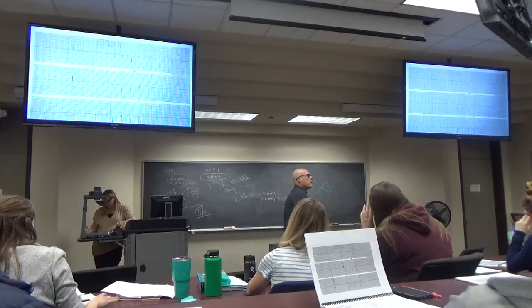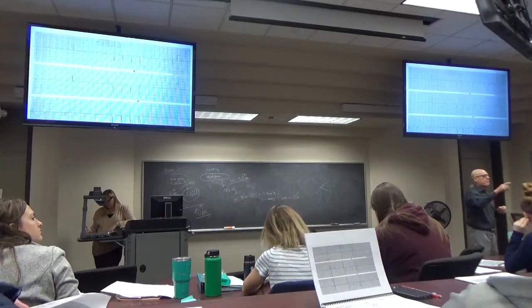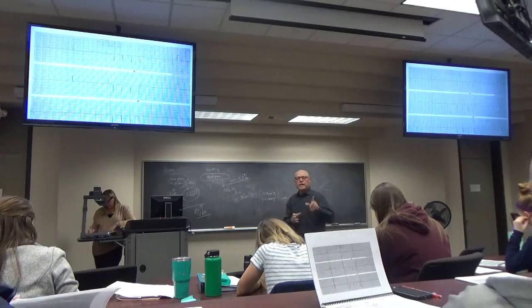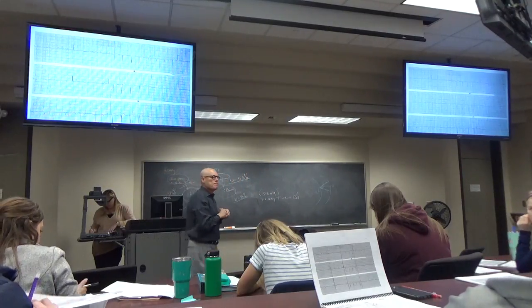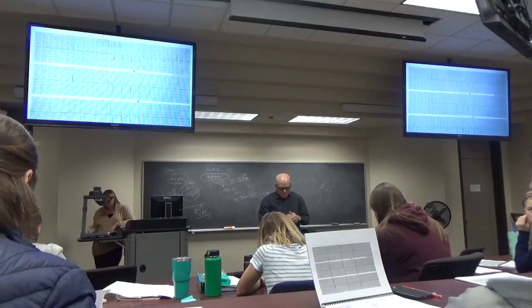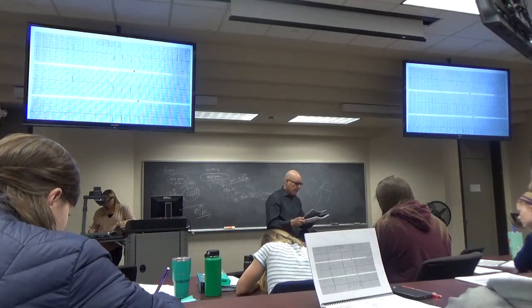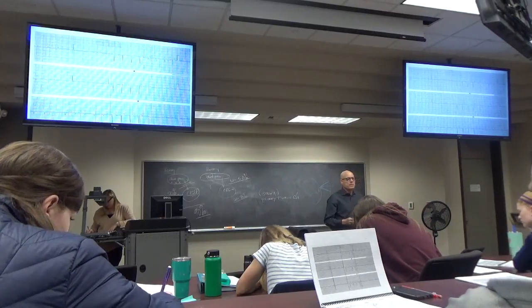So that would make you look more carefully at the ST-T waves in one or the other. And it looks like maybe the ST-T waves in the inferior leads might be off. Any other observations on this one? Yeah. I got left atrial hypertrophy because of the inverted T waves in V1. Is that wrong? Because of the biphasic P wave in V1. Yeah. Is that right? Yes.